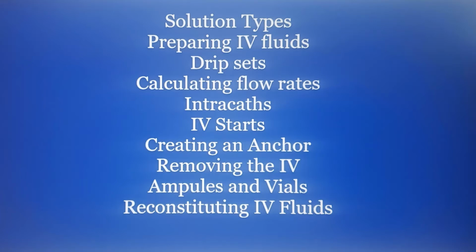We are continuing with Nursing Series 3101L. Today we'll be dealing with solution types, preparing the IV fluids, drip sets, calculating flow rates, Intracaths, IV starts, creating an anchor, removing an IV, ampules and vials, and reconstituting IV fluids. It's a little bit longer than my typical video, but I believe you will enjoy it.